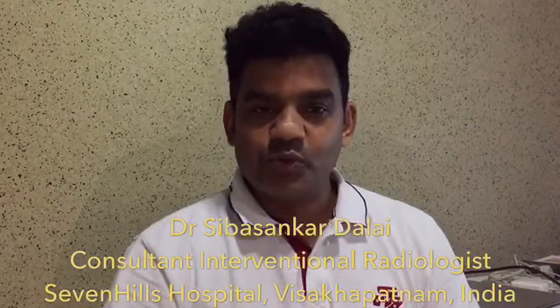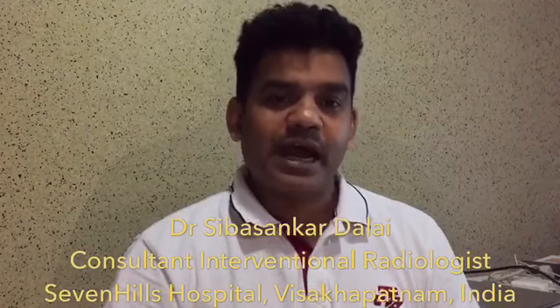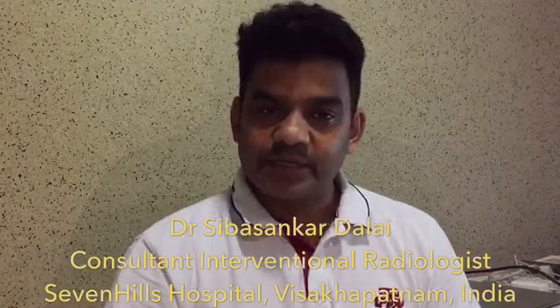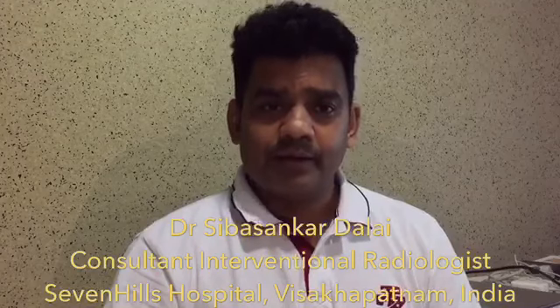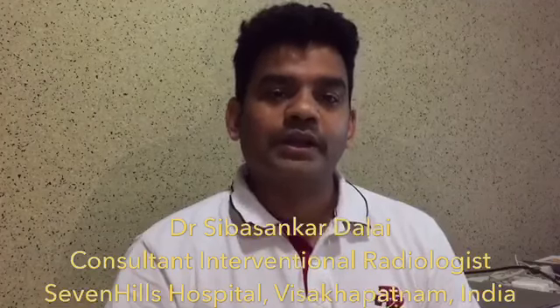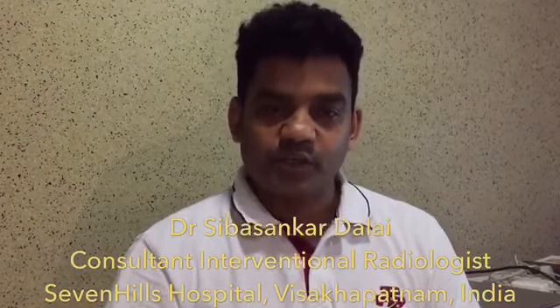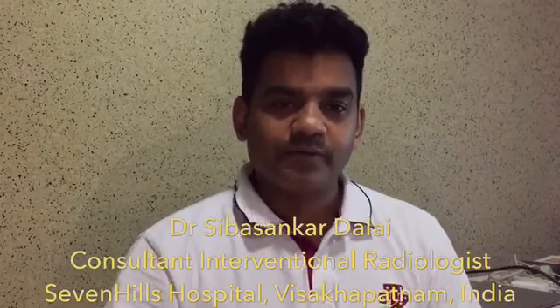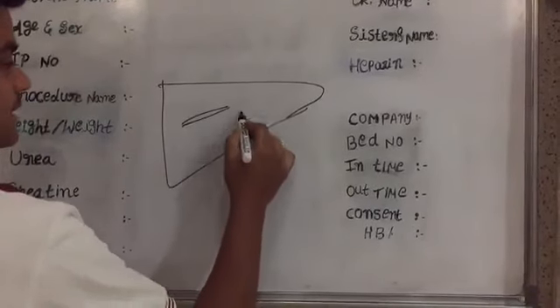Today we are going to show you a case which is very complex in its nature. The reason being, this patient has long segment IVC occlusion for a long time, and she is presenting to us with a non-healing ulcer of the lower leg. We must understand that it is very difficult to open a chronically occluded IVC. So we are going to discuss a special technique that we use to treat such patients with long-standing, long segment IVC occlusion.